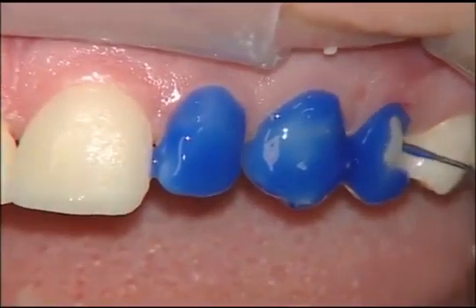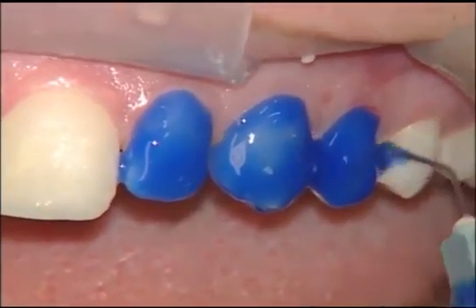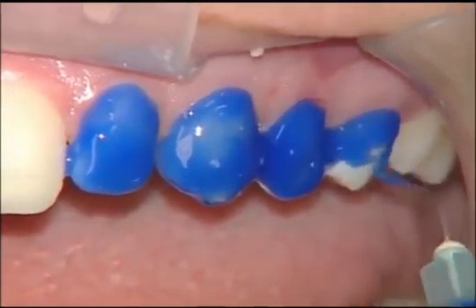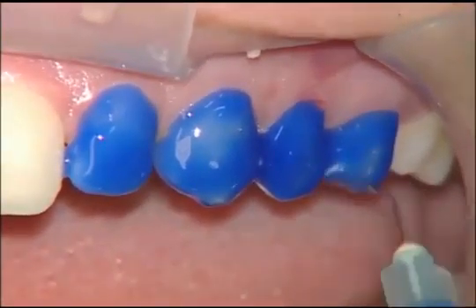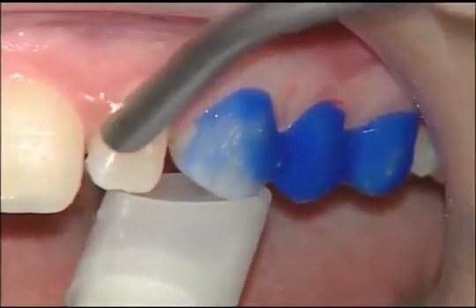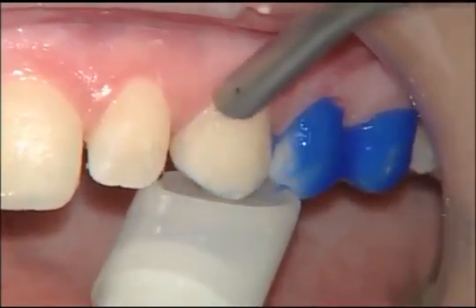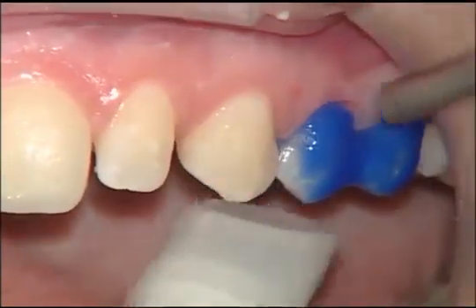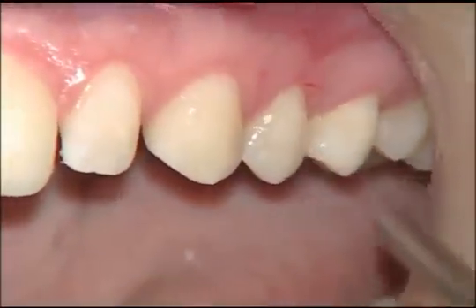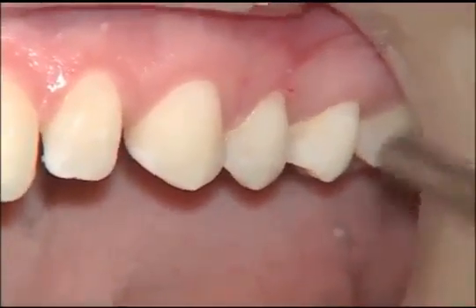So at this point, we're going to go ahead and etch the lateral incisor, the cuspid, and the first bicuspid. And we're just slowly moving our way posterior. We're going to get the second bicuspid here, and then because these veneers do wrap onto the occlusal, we will get some etch on the occlusal surfaces as well. Then, after waiting 15 seconds for the etch to take place, we will rinse off all the acid etch from these teeth and dry them, and then follow the same bonding steps that we proceeded with before on the central incisors.